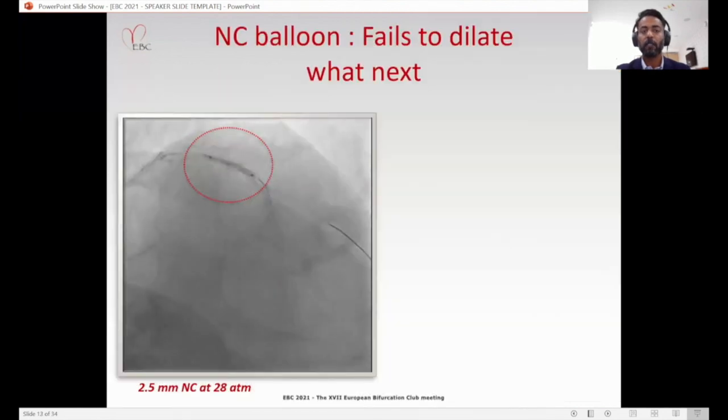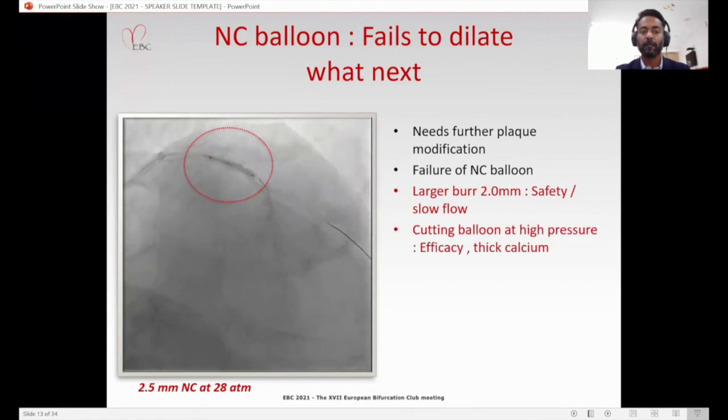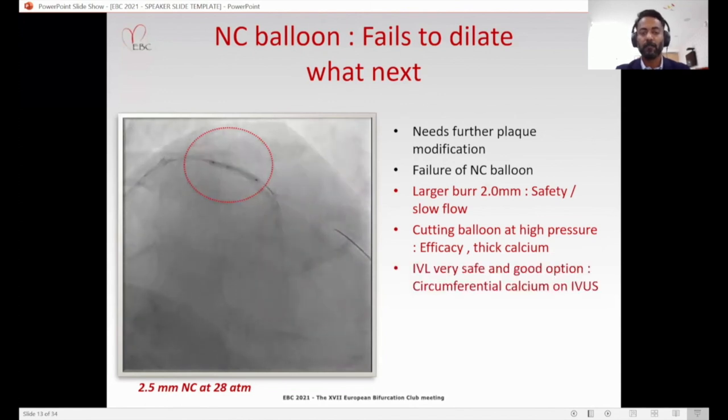After the IVUS, we took a 2.5 millimeter NC balloon, which failed to dilate at 28 atmospheres. So we were left with a few options. One option was to use a 2 millimeter burr based on the IVUS findings and MLD of 2 millimeter. But we thought probably the risk of slow flow and no flow would be very high. And also the patient had an occluded right and a very advanced age. The second option could have been to use a cutting balloon at high pressure, which sometimes does not work as the calcium appeared very thick on IVUS.